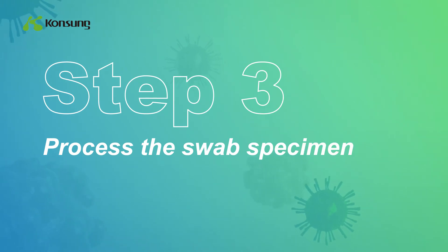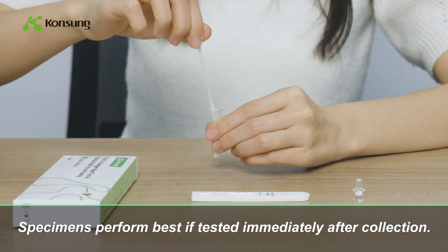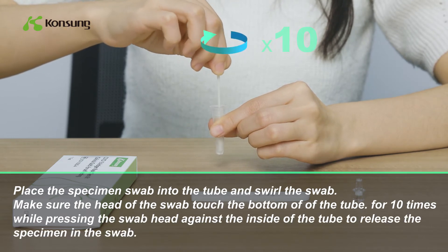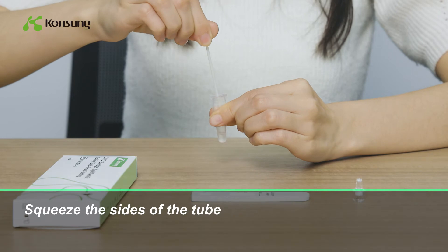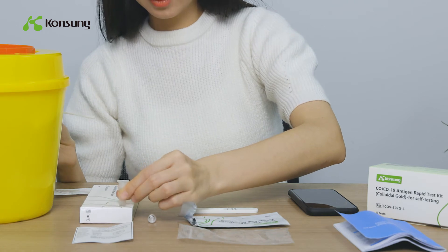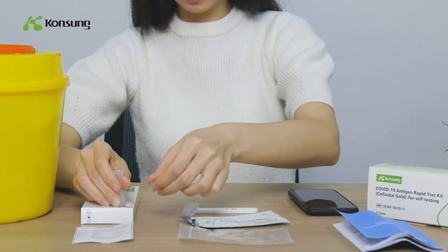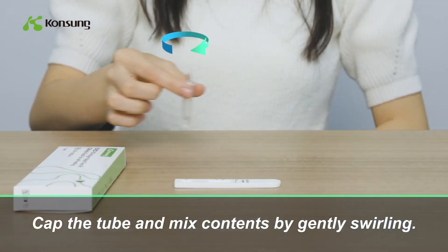Process the swab specimen — specimens perform best if tested immediately after collection. Place the specimen swab in the tube. Make sure the head of the swab touches the bottom of the tube and swirl the swab 10 times, pressing the swab head against the inside of the tube to release the specimen. Squeeze the sides of the tube to express as much liquid as possible from the swab, then remove the swab. Cap the tube and mix contents by gently swirling.